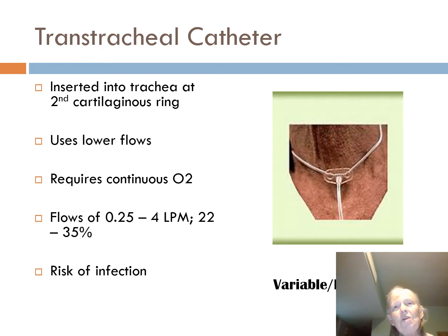And then there's this thing called mucus balls. The literature calls them mucus balls also. What they are is mucus plugs. So if your patient is getting dry, their secretions are beginning to dry and they're going to form these little mucus balls. And it will go ahead and block up the end of the transtracheal catheter. And that's one reason why you need to be able to keep it clean, okay? You probably have seen in the drugstores that they have those like little aerosol cans that have normal saline in it, and people will use those. They'll just put it on their transtracheal catheter and go ahead and squirt some of the normal saline in there and try to push those mucus plugs or mucus balls away.